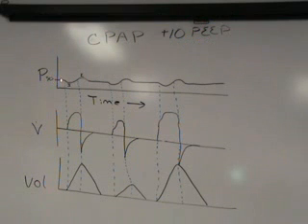The baseline at 10, you see that the baseline drops during inspiration because the person is inhaling, and therefore that pressure can't stay perfectly at 10 in the circuit. And as the patient exhales, you see the pressure go up a little bit. And therefore we have three different breaths here being demonstrated, with inspiratory pressure going down and expiratory pressure coming back up.